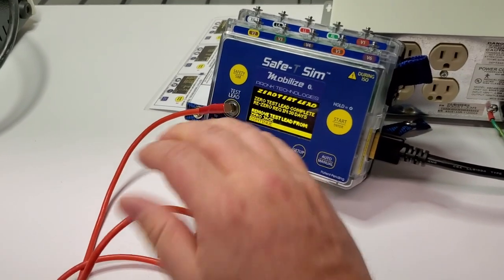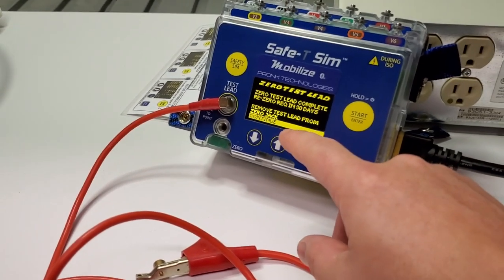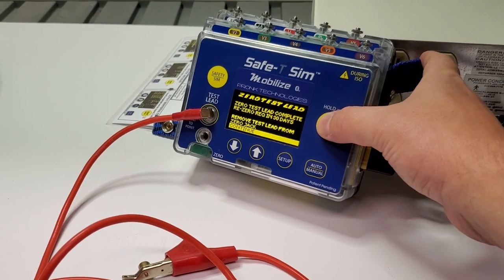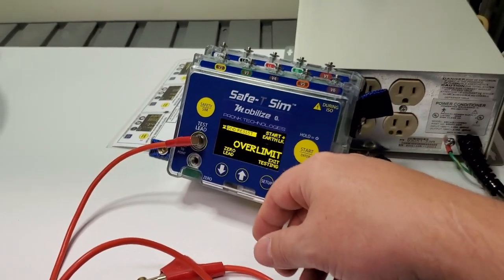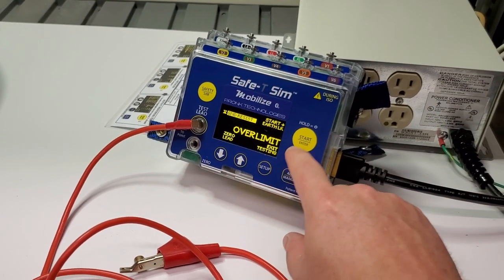It does it automatically — there's no need to press a button. Your options from here are to remove and zero the jack or to continue. We're going to continue, hit enter, and now it's ready to do earth leakage checks on your equipment. Let's go ahead and exit back out.